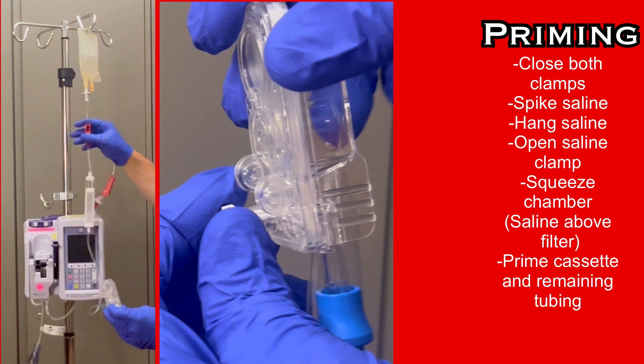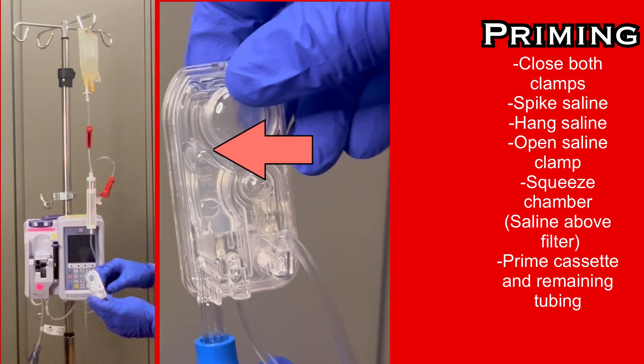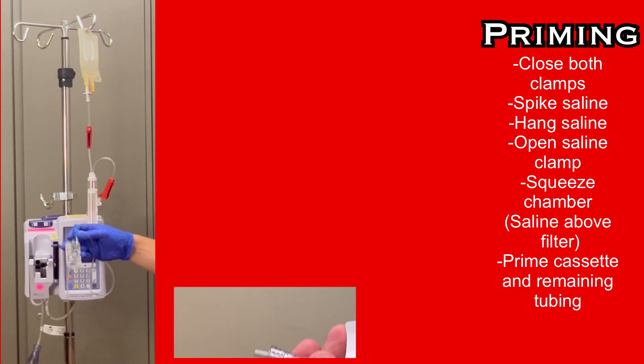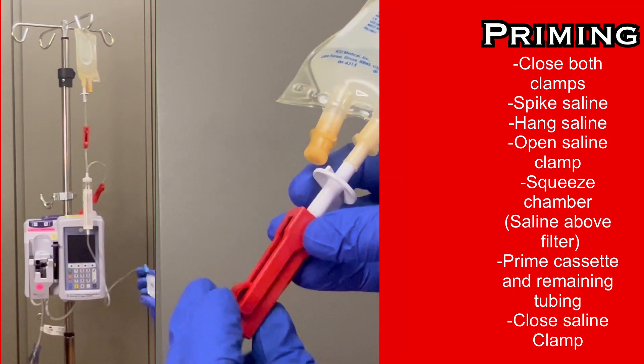Invert the cassette. Pull the white plug open. Saline will begin to fill the large chamber on the cassette, and once it has completely filled, flip the cassette to allow it to continue to fill the remaining chambers and push all air out of the cassette. Then allow saline to run through the rest of the tubing before pushing the white plug closed. Then close the roller clamp below the saline bag.